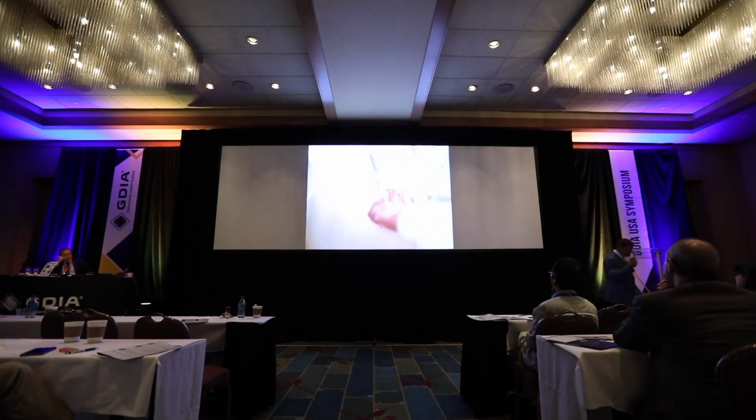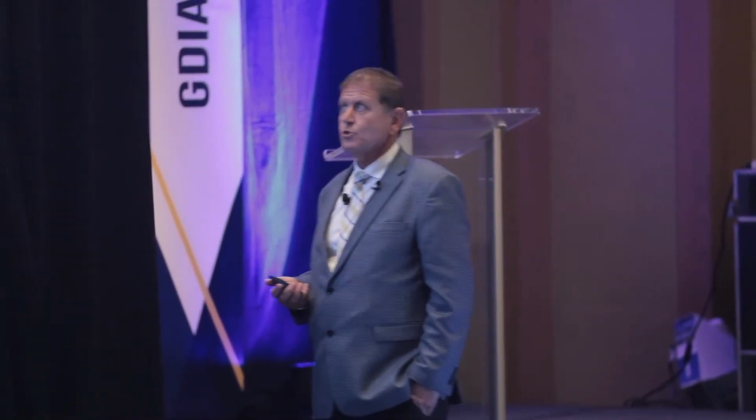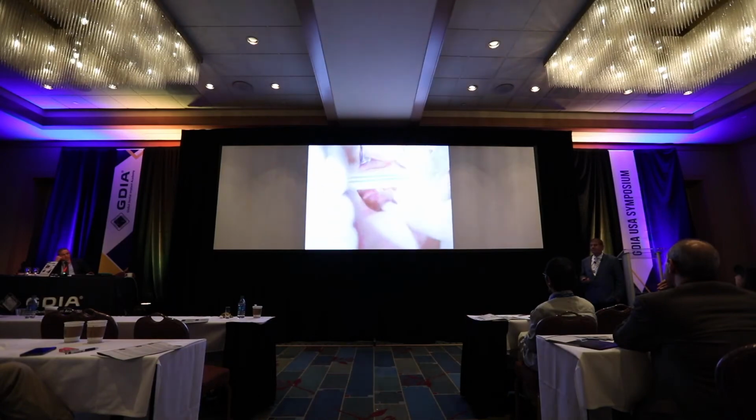One thing is important, not to use it with infected sinus. Like with any graft, we don't use graft in an infected site because there is no blood supply in the graft at the beginning. Press. That's all. Now, I didn't do sinus lift here. I just close it. No membrane is used, just primary closed.